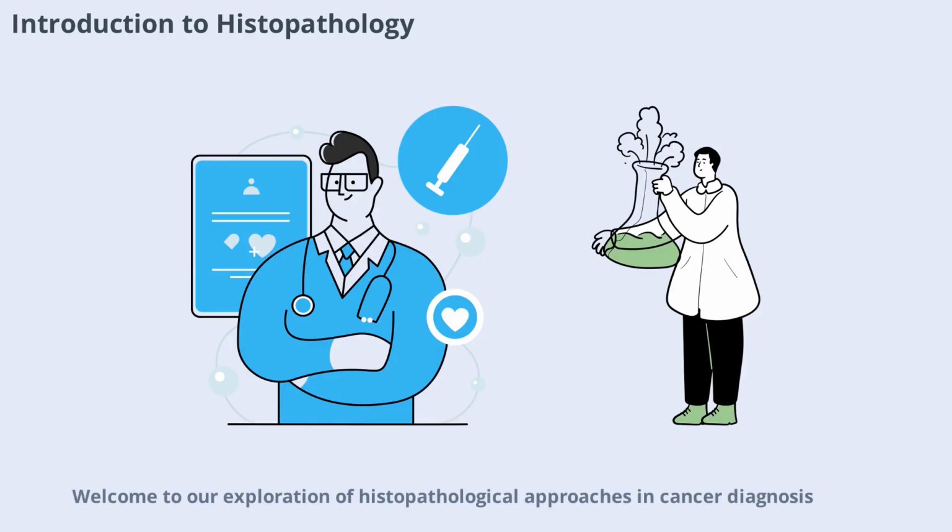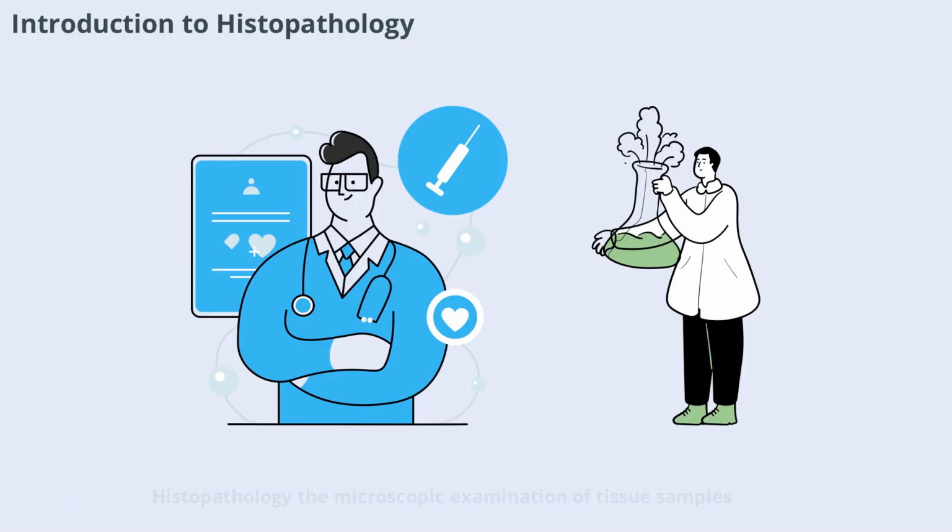Welcome to our exploration of histopathological approaches in cancer diagnosis. Histopathology, the microscopic examination of tissue samples, is a cornerstone in modern cancer detection and management. By analyzing tissue architecture and cellular details, pathologists can identify abnormal growths and distinguish between benign and malignant lesions. This process not only confirms the presence of cancer, but also provides crucial information about its type and state.